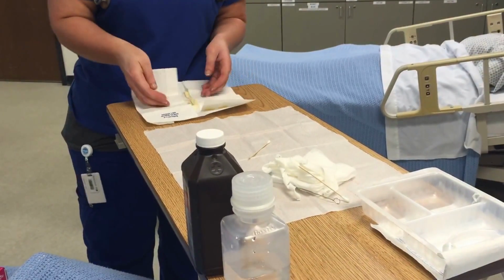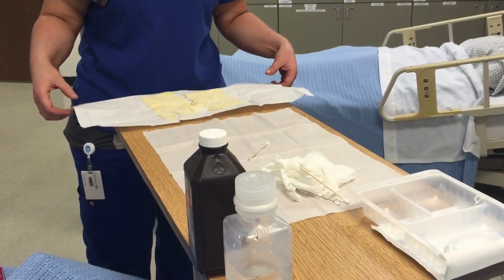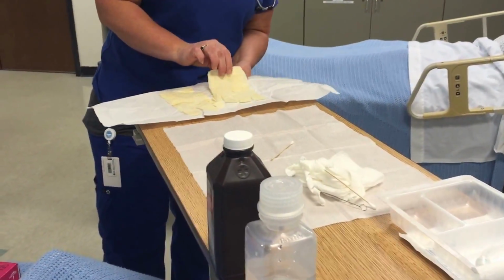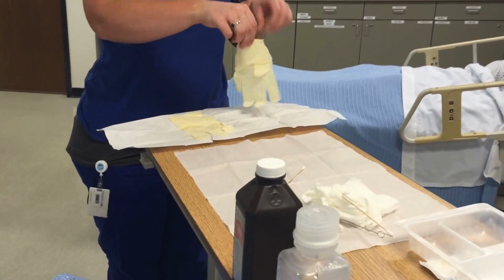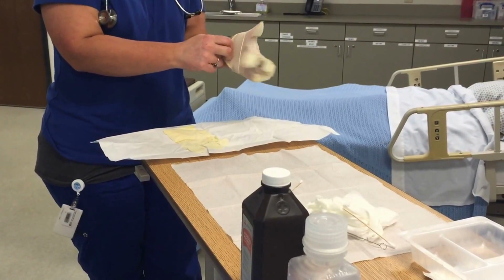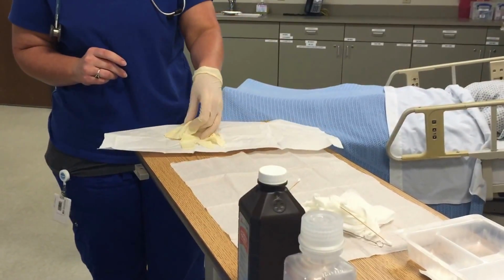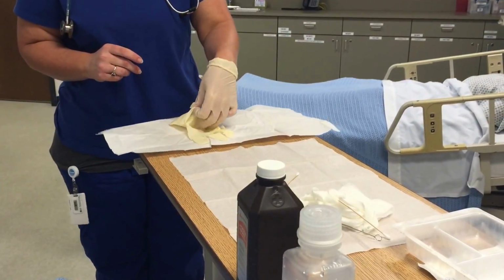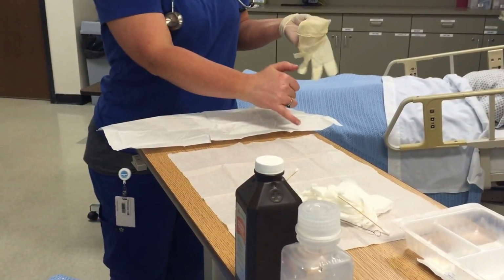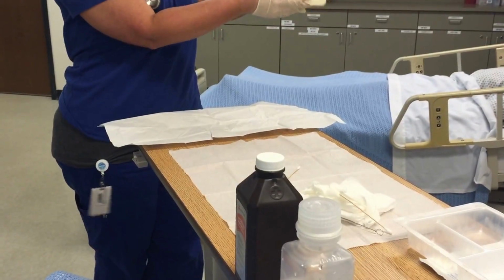Again, you have to just practice these to where it's going to work for you. Can't say practice, practice, practice. Alright, so sterile gloves again. Alright, so I'm going to take note because this kind of crossed my field a little bit, that I'm not going to use that little corner.